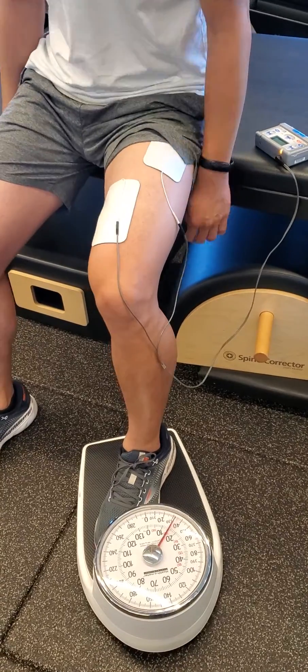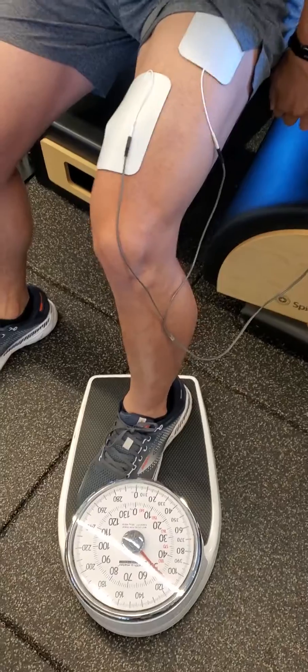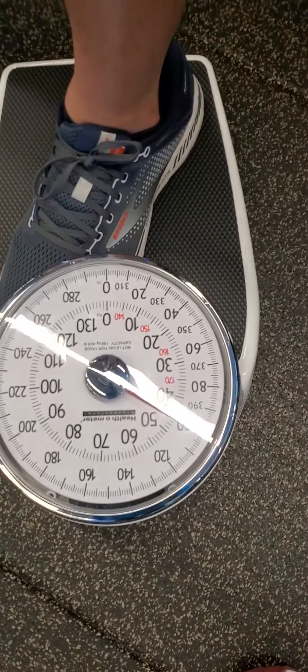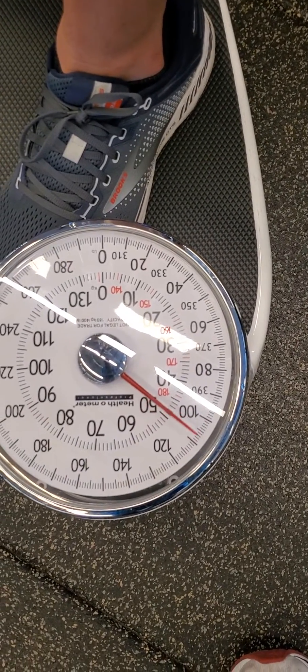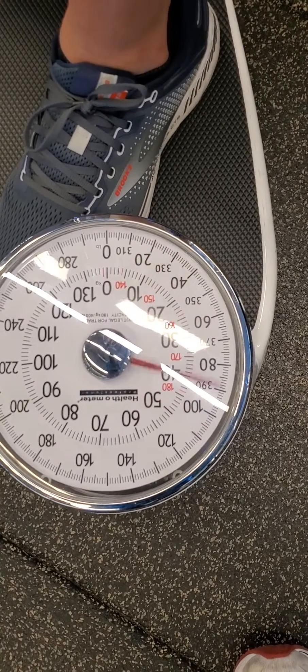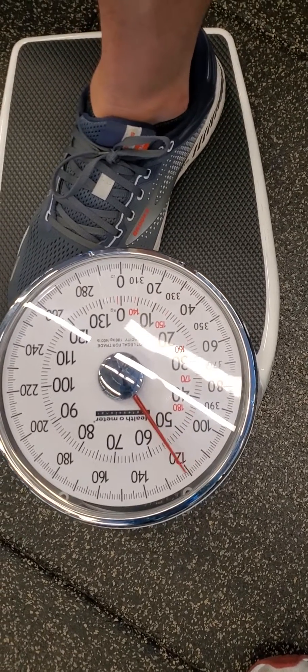Ten seconds on, and then relax. So without the stim, our force is much less — we're hovering right around 110, 100. Notice the shakiness of the needle. And there's the stim now kicking in — 120.